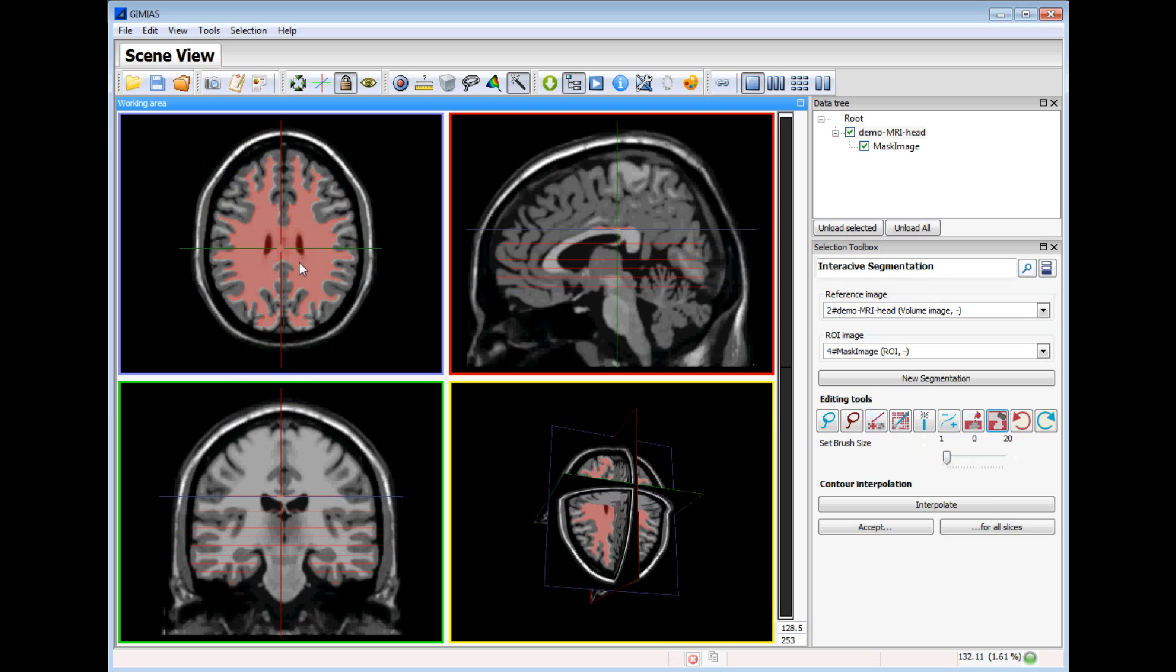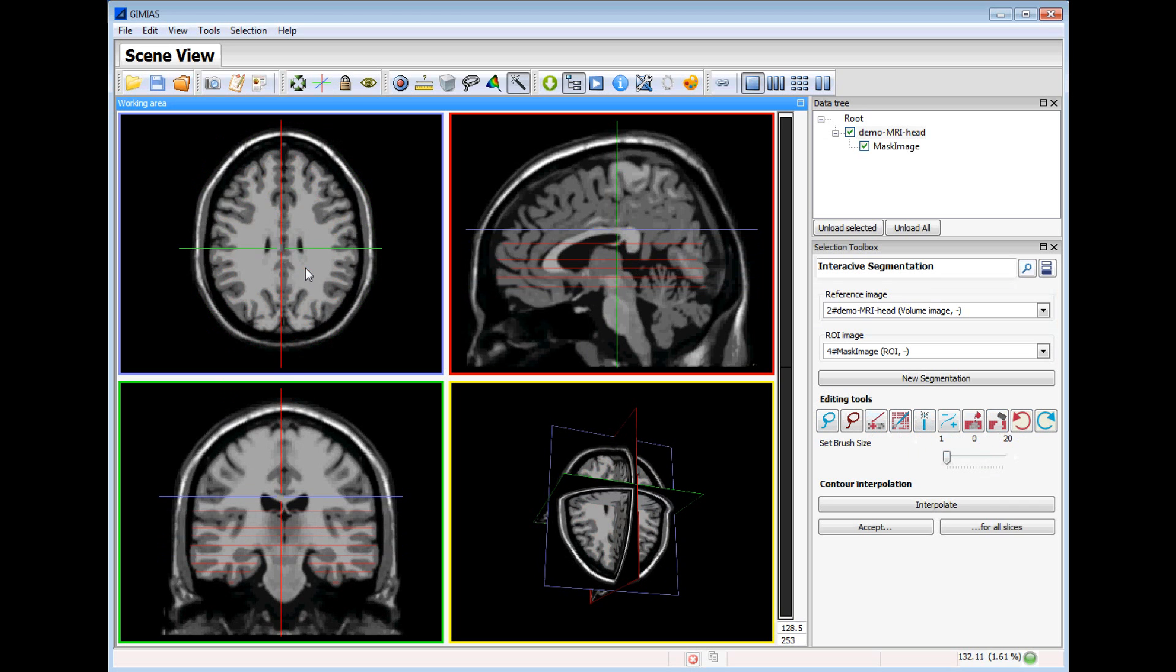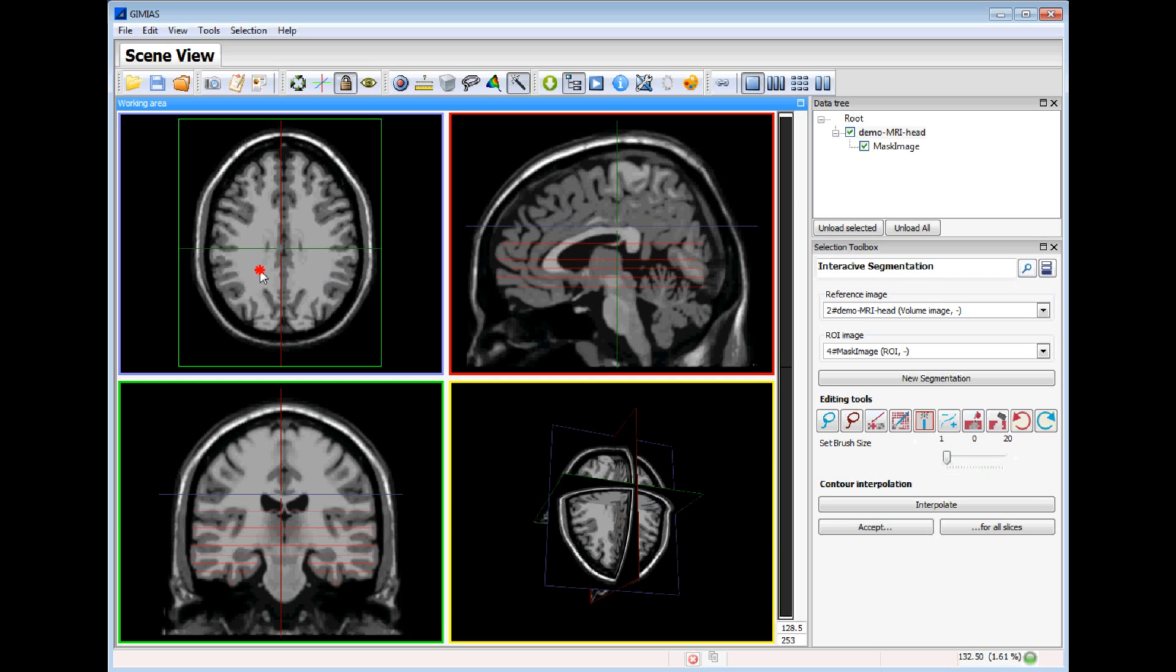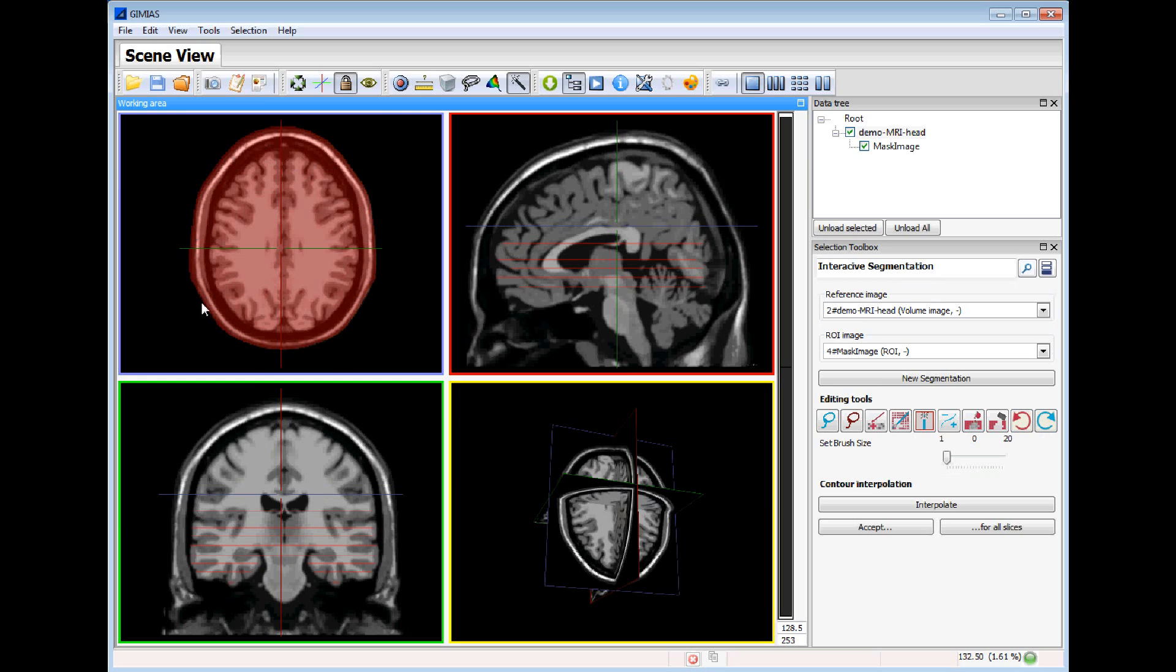I will remove this part and continue to another slice. If this segmented part is not correct I can also use the undo function.